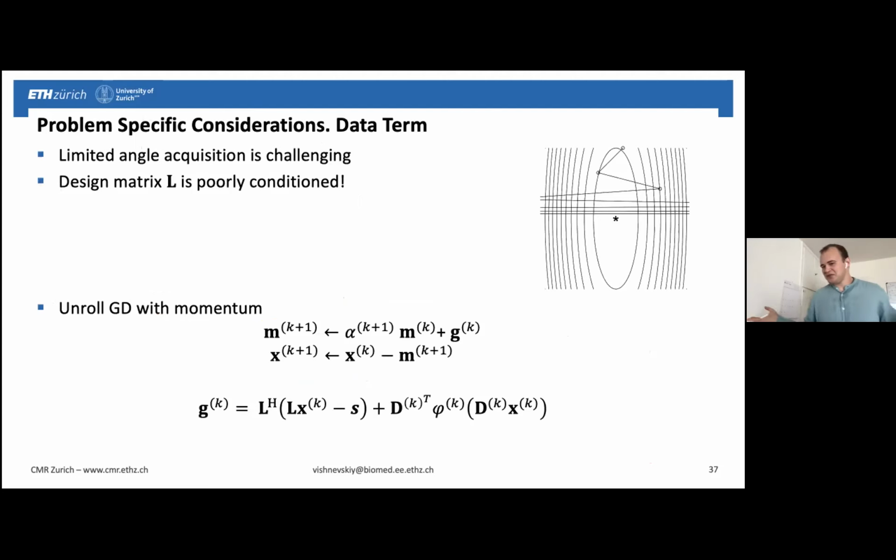And now there are a few slides, but I think the easiest way to follow it is, what would you do if you were implementing the classical reconstruction method based on the models? Well, if you knew that you have a poorly conditioned acquisition matrix, called L in this case, by the way, first thing, you know that if we plot the level set of the cost function, if there are some elongated valleys like here, the descent methods will oscillate a lot and will even diverge.